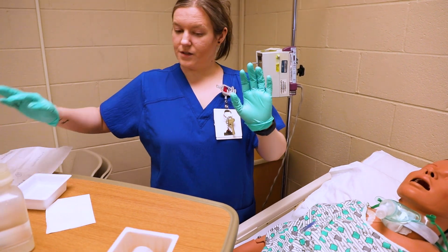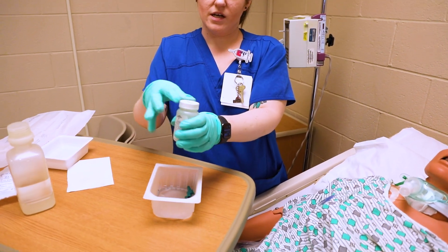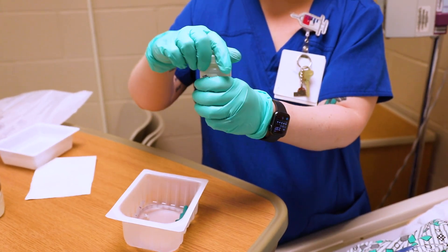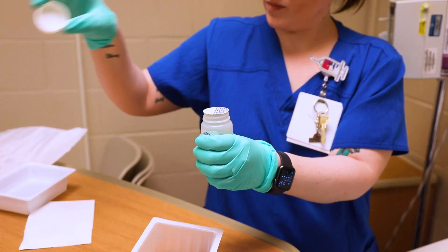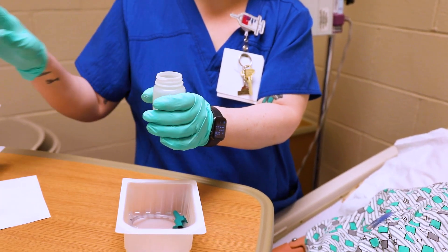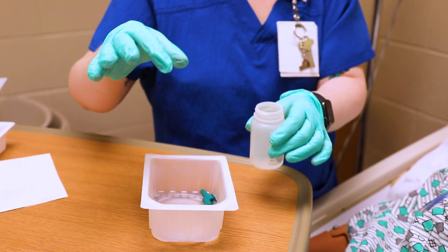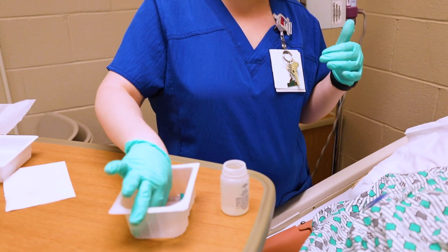I've got my sterile gloves on. I'm going to reach into my kit — remember, I can reach into my kit now that everything's sterile. I want to open this up. Remember, if you drop anything it has to be six inches above before dropping it. You should already have suction hooked up for your patient because they have a trach.